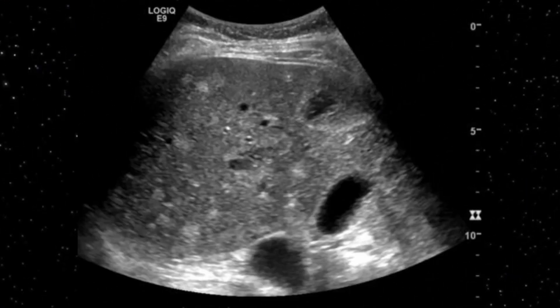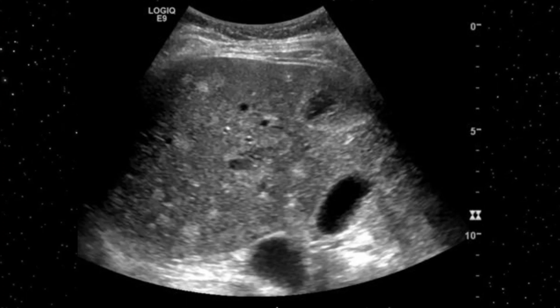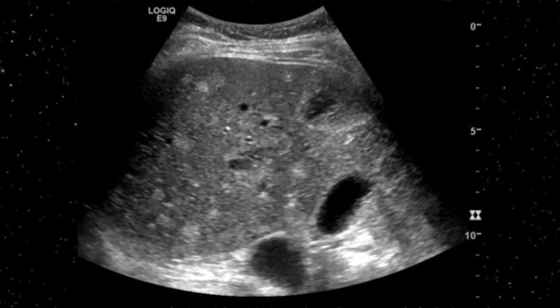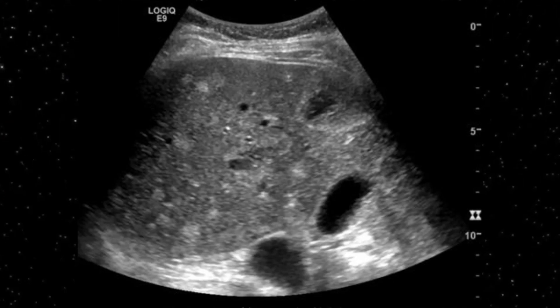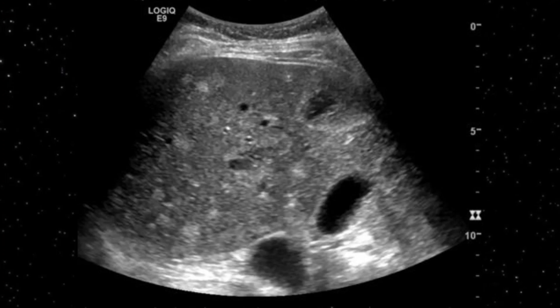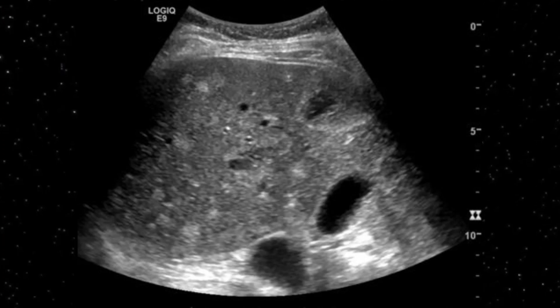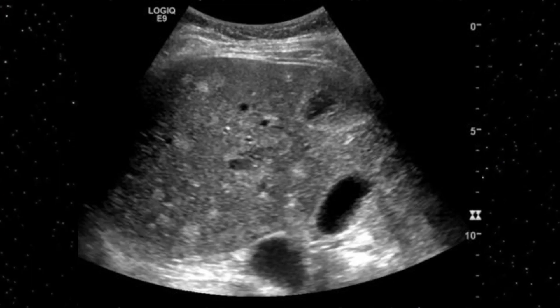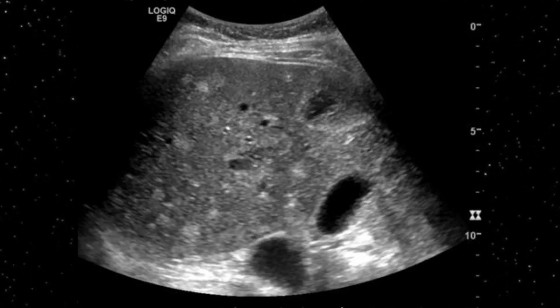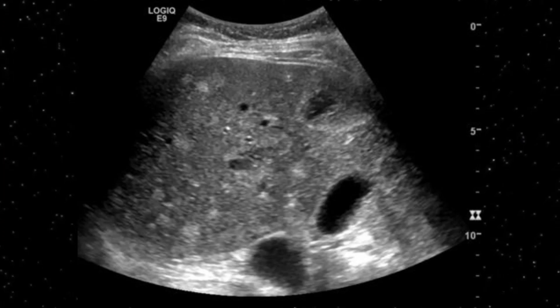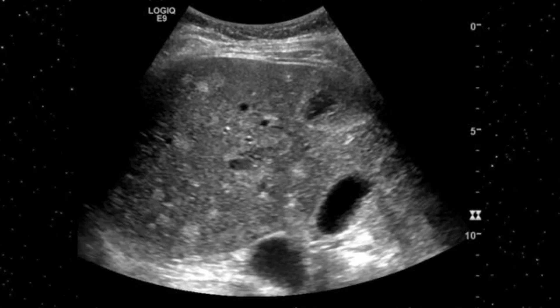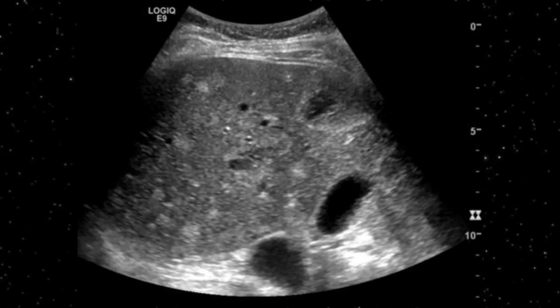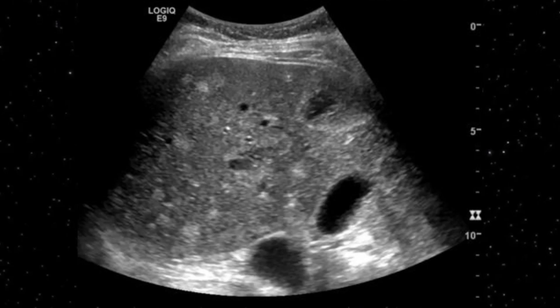This is a transabdominal scan. You can appreciate a well-defined liver with clearly visible margins and borders, and the gallbladder is also within view. The liver parenchyma is interrupted by multiple echogenic nodules evenly scattered in the right and left lobes — this is biliary hamartoma. As mentioned, the lesion size is between one to three millimeters.